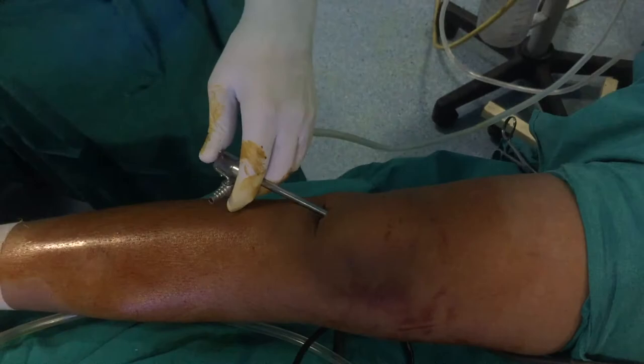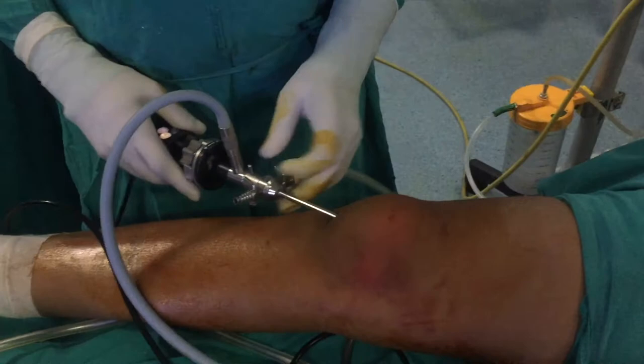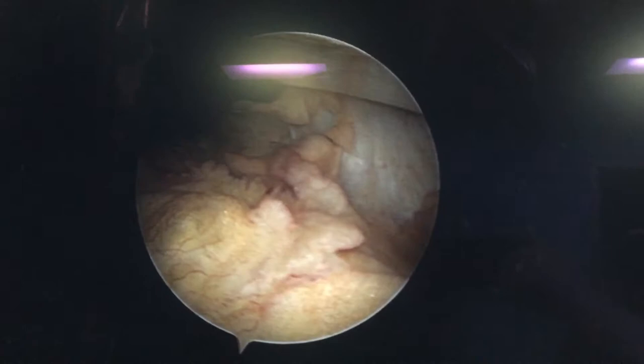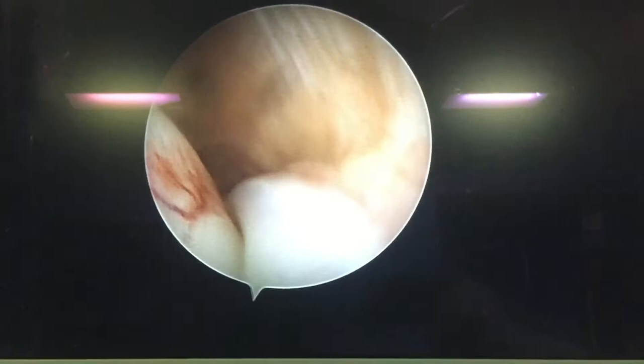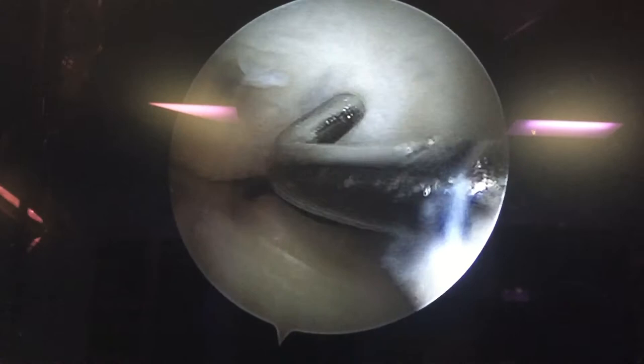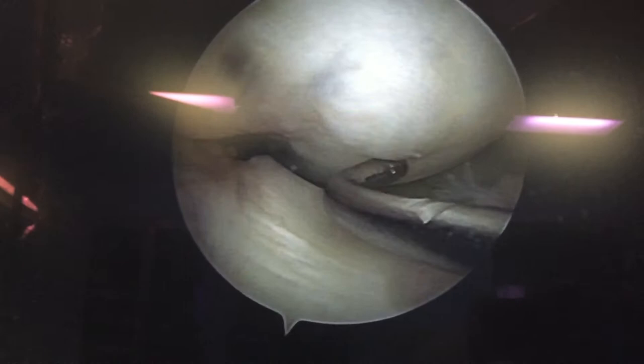You can see there is a clear suprapatellar pouch. This is the fat pad, plica, and now on the medial gutter there is the medial meniscus, femoral condyle, and tibial condyle. So a nicely looking medial meniscus, and this is the lesion which we already saw in the X-ray and MRI.